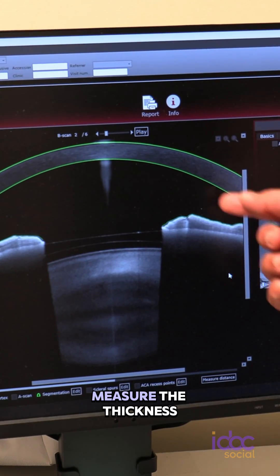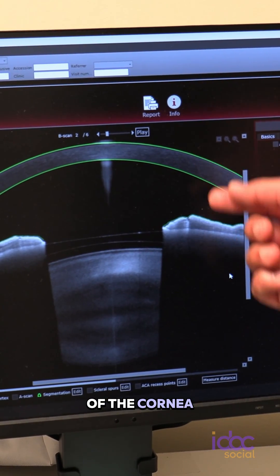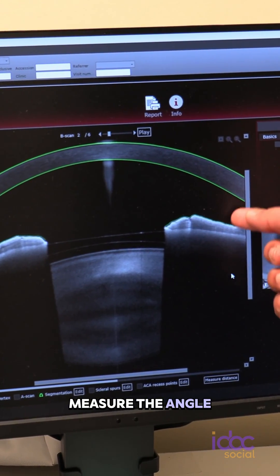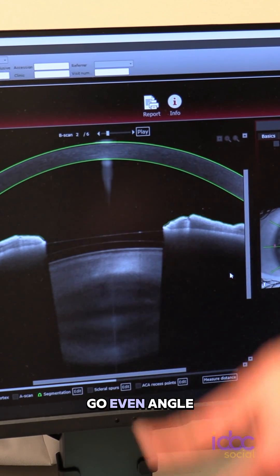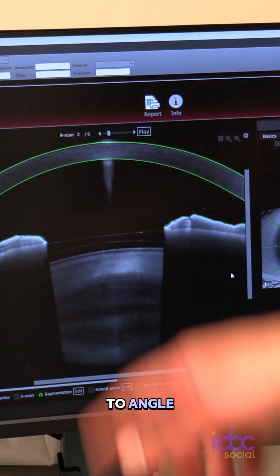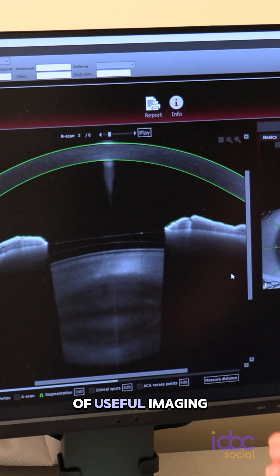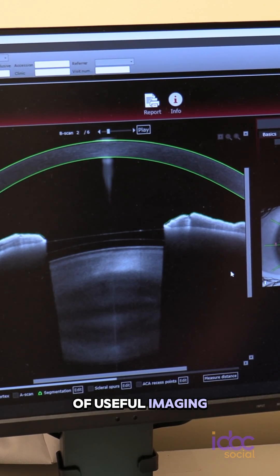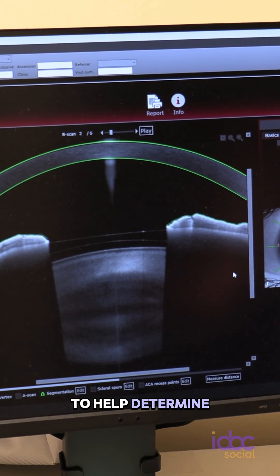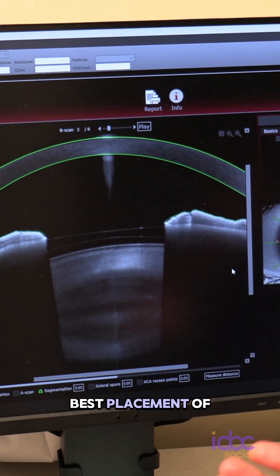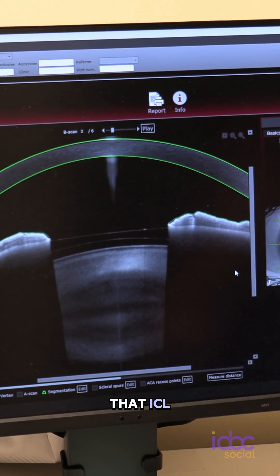You can also measure the thickness of the cornea, measure the angle here, and go angle to angle — along with other useful imaging modalities — to help determine the best placement of that ICL.